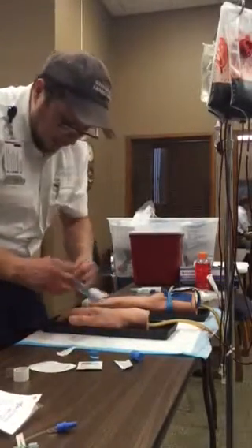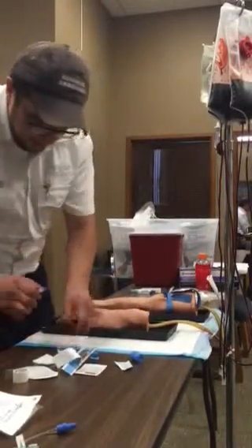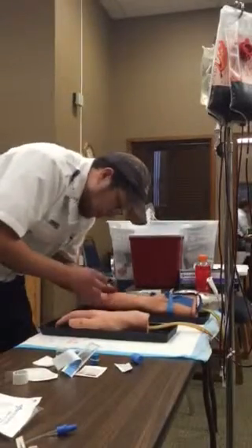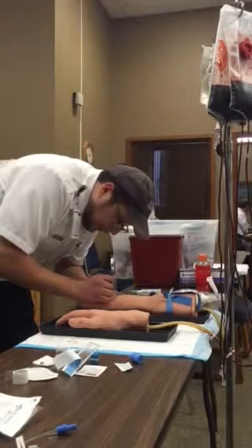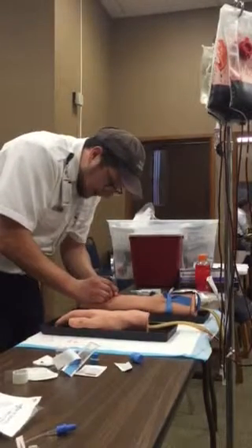Alright, I'm going to grab an appropriate size catheter for my vein here. Making sure your bevel side is up. I'm going to pull some traction on the skin, and on the count of 3 I'm going to tell my patient I'm going to poke him. Ready? 1, 2, 3. Alright, I got flashback there.